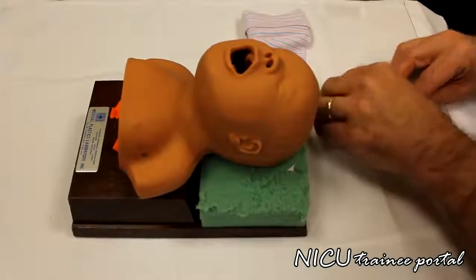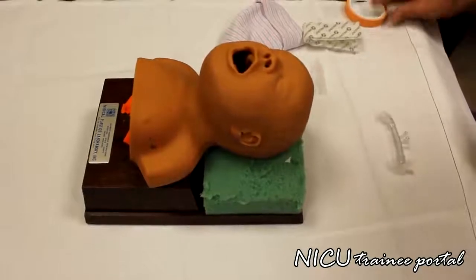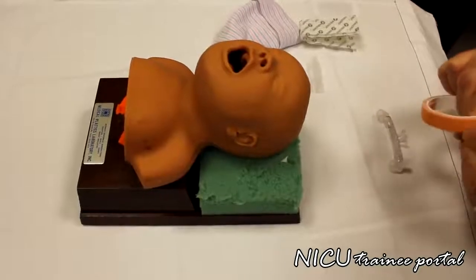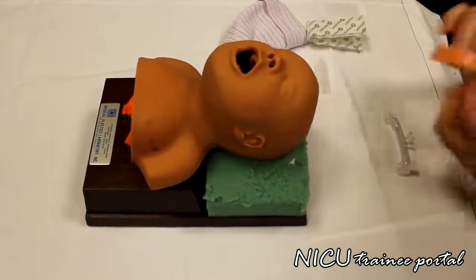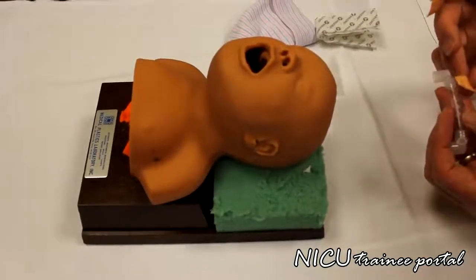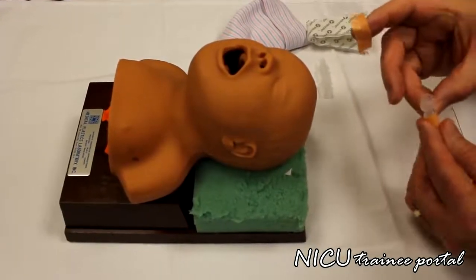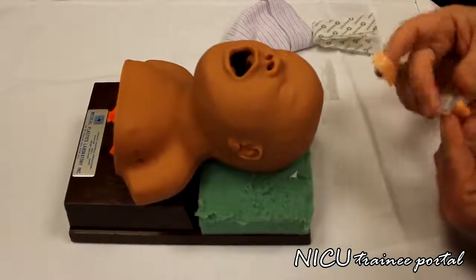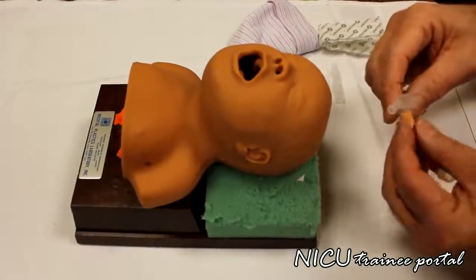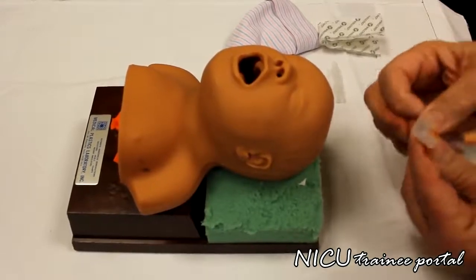And first thing I do is I apply the Velcro to the prongs, and we use the 1/2 inch pink tape. The pink tape right at the end of the barrel here, as flat as possible. Do the same on the other side. This just makes the Velcro stick better with the pink tape. Try to get it as flat as you can.